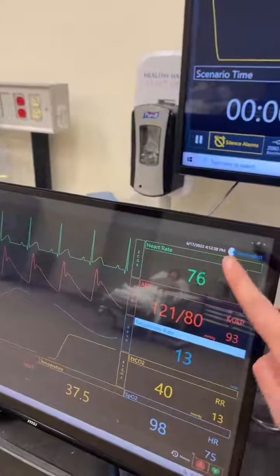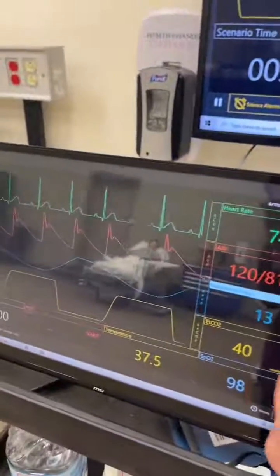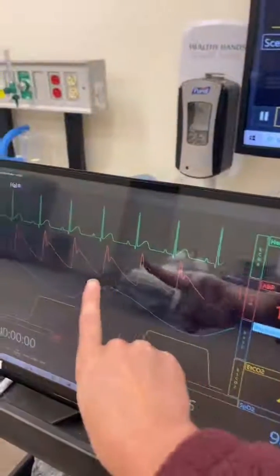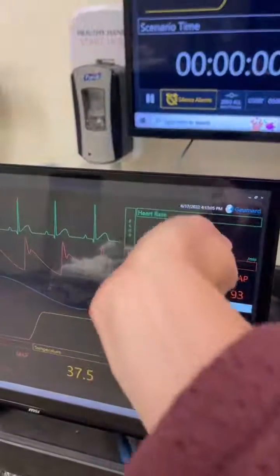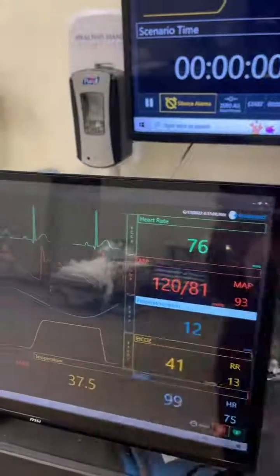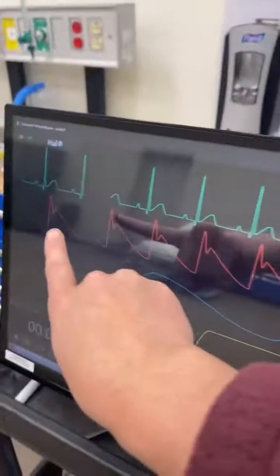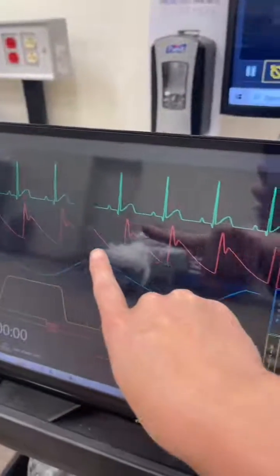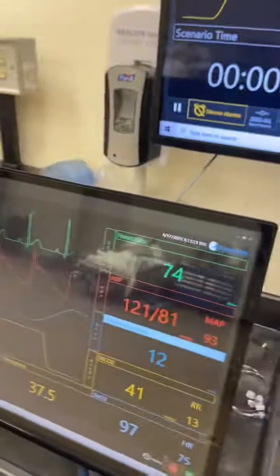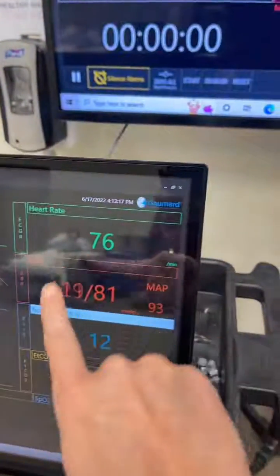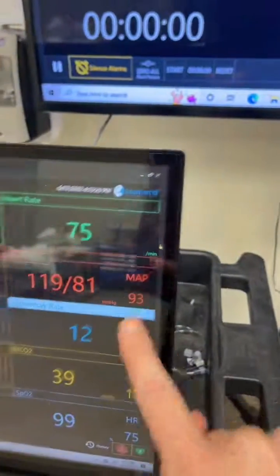You can change these colors, but I would not. This next line here is their arterial line — a catheter often in their wrist, continuously monitoring blood pressure through an artery. That's the arterial waveform, which if you're in the ICU you're going to have to learn how to interpret. And then this is their blood pressure and their mean arterial pressure.